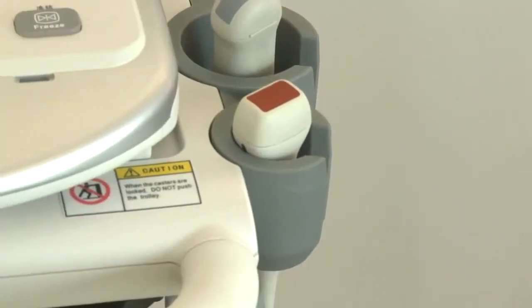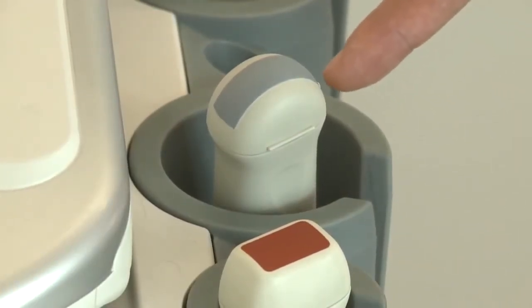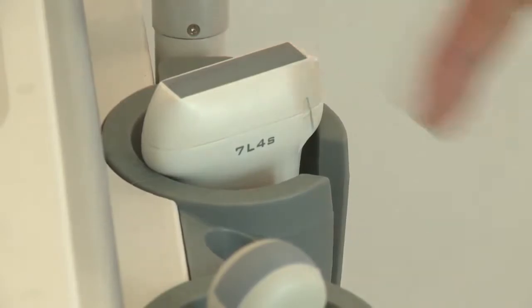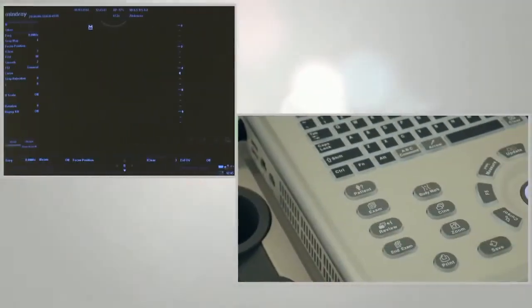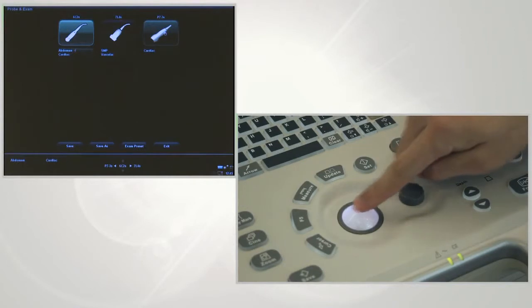Choose the right probe according to different applications. The microconvex probe is used for small animal abdominal exams, the linear probe is for vascular and MSK exams, and the phase array probe is for cardiac exams. Press the exam button, roll the trackball to select the right probe and application, then press Set to confirm.